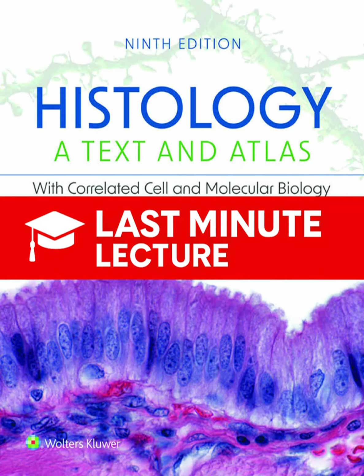The big insight is that you're using a simple physical measurement, light absorption or fluorescence, to figure out how malignant a tumor is. Pathologists use these methods to analyze ploidy in all kinds of cancers: breast, colon, endometrial, kidney. And how does that relate to a patient's prognosis? Well, tumors that still have a mostly diploid pattern are generally considered well-differentiated. They tend to have a better prognosis. And the opposite for aneuploid tumors. Exactly. Tumors that show aneuploid or tetraploid patterns are usually more aggressive and are associated with a poorer prognosis. So this quantification gives crucial information that helps guide treatment plans.